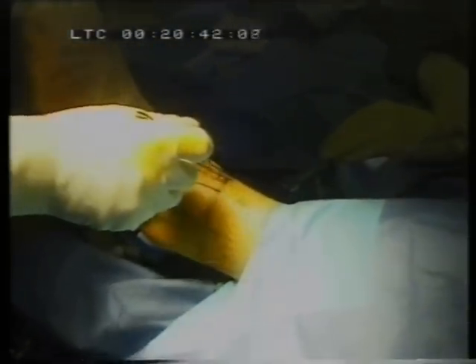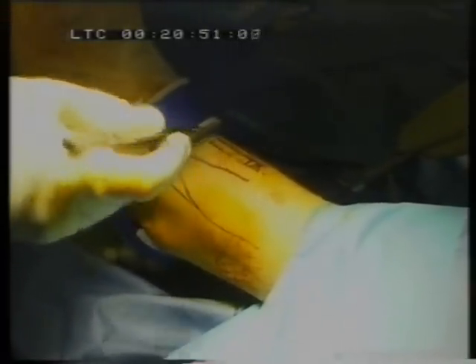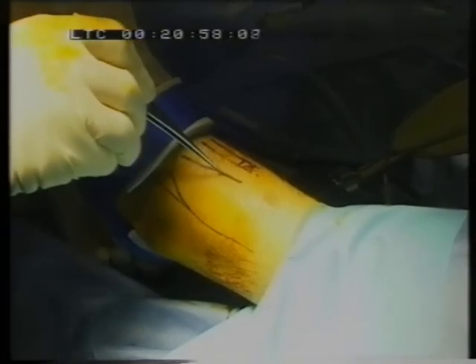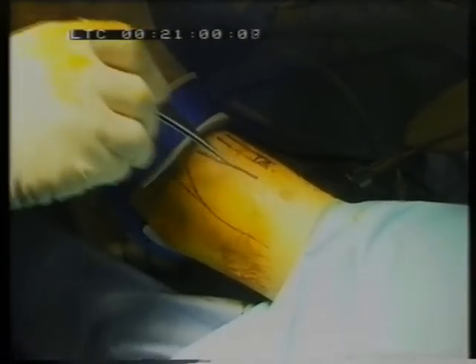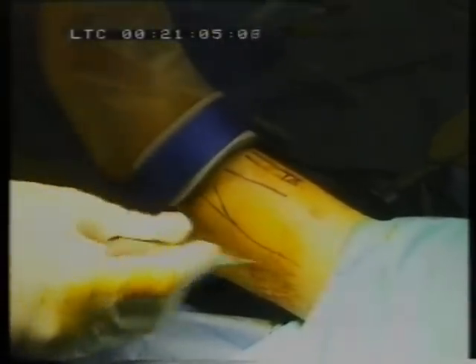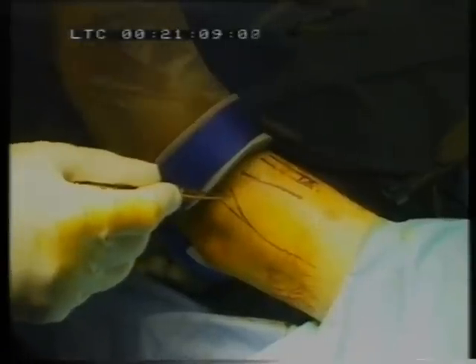We look at the front of the ankle. There are a number of neurological and vascular structures which pass across the front of the ankle which you need to avoid in placing your portals. This is tibialis anterior which I've marked here, and over to the side is where the saphenous vein and nerve are. This line here represents the deep peroneal nerve, and over here the superficial peroneal nerve, which is quite variable in its passage across the lateral aspect of the ankle.